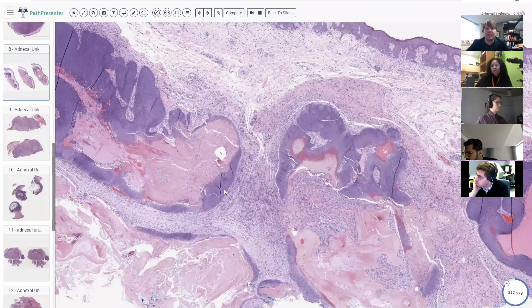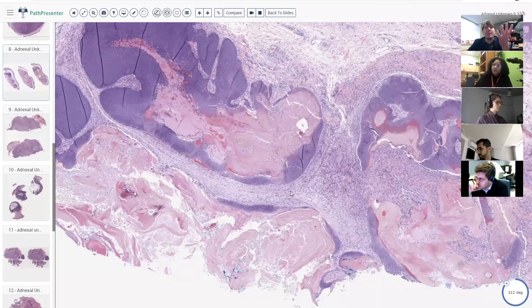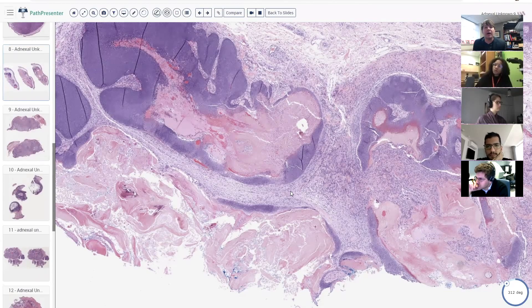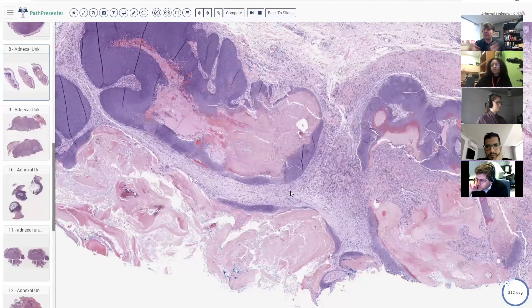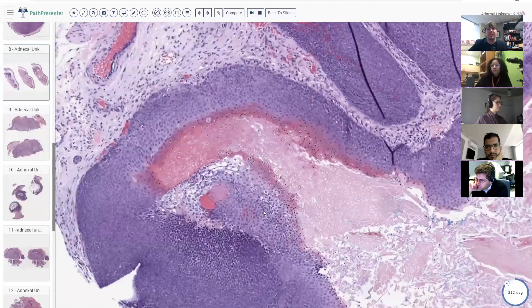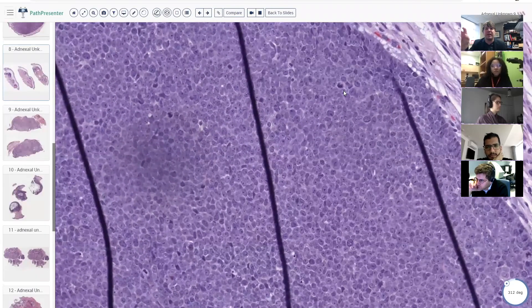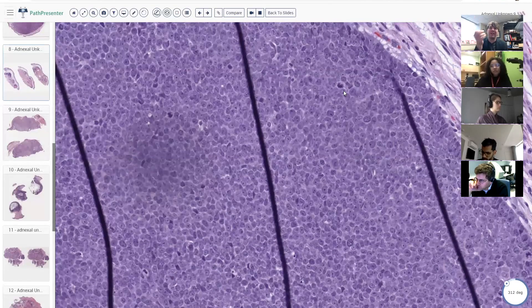Pilomatricomas are thought of as pediatric tumors, but I've seen them in patients of all ages — the last one I diagnosed was in a 75 or 80 year old just weeks ago. They can also be quite large. I saw one on the elbow of a 60-something year old that was six centimeters, a violaceous nodule — our orthopedic oncologist thought it was going to be a sarcoma. After resection, it looked perfect for pilomatricoma: perfectly circumscribed, no atypical mitoses, no pleomorphism, and years later no recurrences. Remember, the reason these have mitoses is because they recapitulate the germinative cells of the hair bulb — those blue basaloid cells in a deep hair follicle look just like this and have mitoses because that's what they do: they grow and divide.